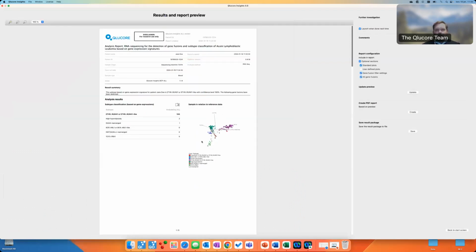It will display here in the same way as when I rotated it, in order to see this red dot a little bit easier. So everything that you see in the results window will also appear here.